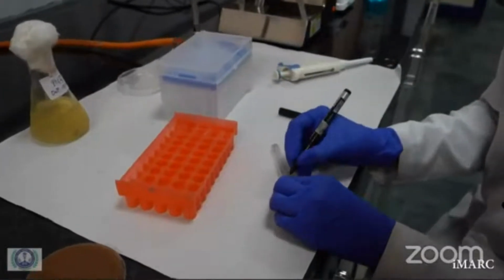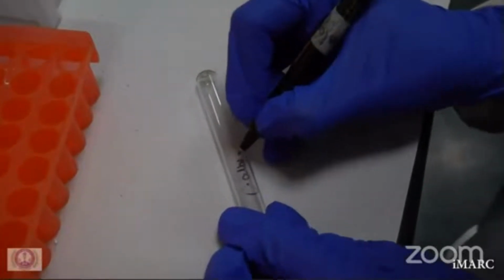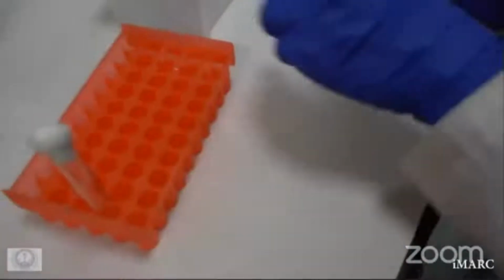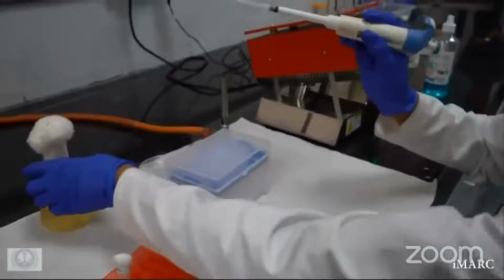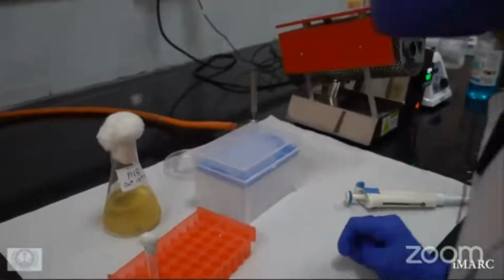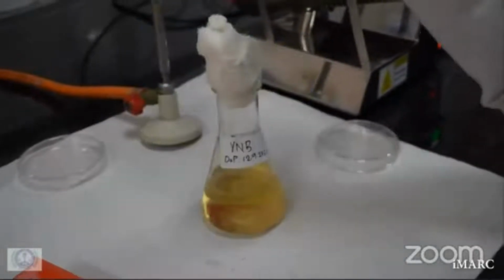The next test is the sugar assimilation test, for which we follow the disc impregnation pour plate auxanographic method of Wickerham. For this, we need to prepare the yeast nitrogen broth 2 ml separately and sterilize by filtration, and it can be stored at 4 degrees Celsius. Agar is prepared in 18 ml quantities and stored separately after autoclaving at 4 degrees Celsius.